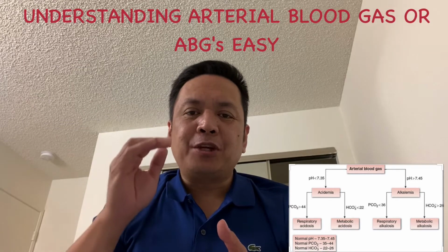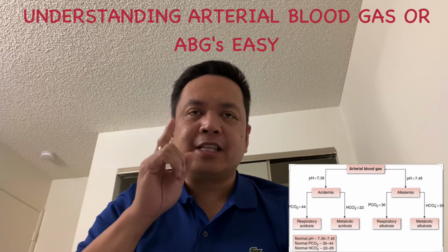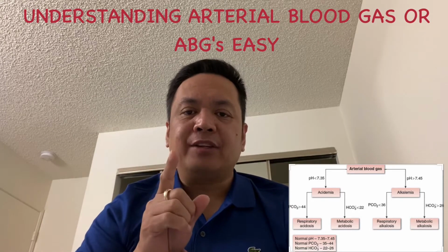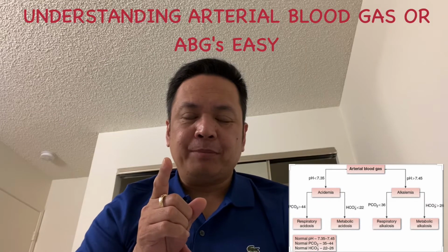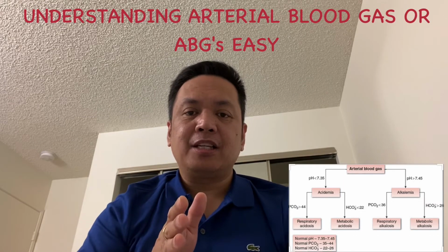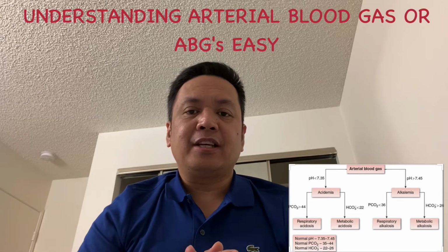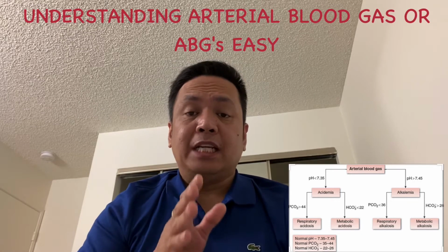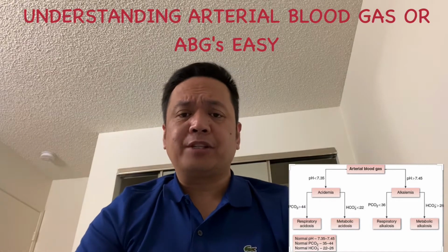So when interpreting ABG results, it is essential that you know what ABG values are considered normal. Because from this baseline, you can then begin to recognize significant variations in a patient's results, which could indicate, I would say, clinical deterioration.